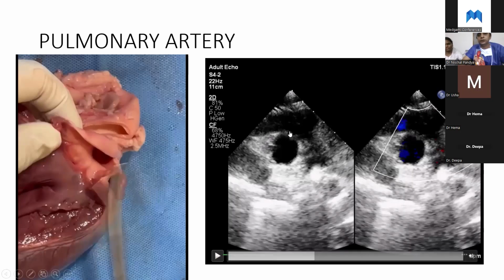Again, when it goes from 2 to 3, 4 o'clock, just under the pulmonary valve is your subpulmonic defect. Under the pulmonary valve, if you see thickening on that anterior wall, there's the RV outflow, anterior wall and the septum here. So this septal wall gets thickened in TOF to make it so narrow that it just blocks it off. It's all white over here, and this is your outflow. So those are your parietal bands basically.